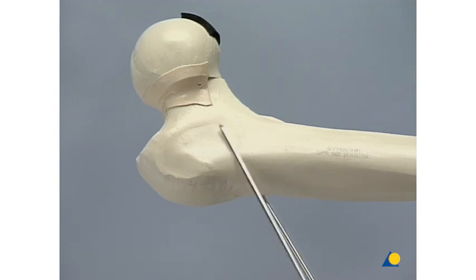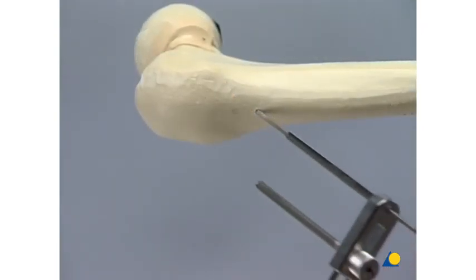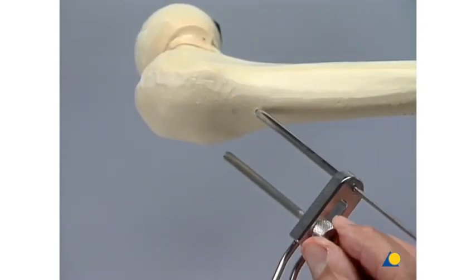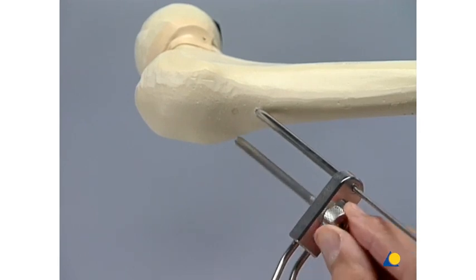We now use the new parallel wire guide. The movable sleeve may be locked at a certain distance and rotated around the first wire, always remaining parallel to it.